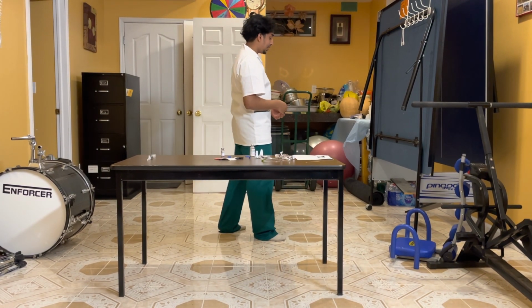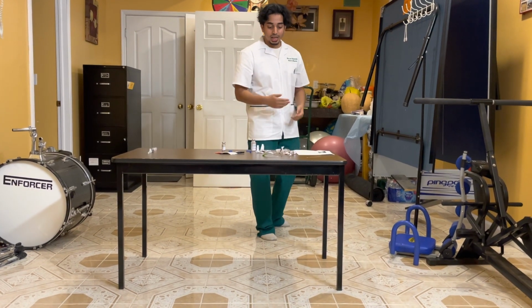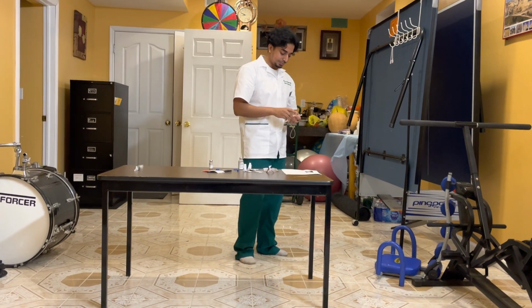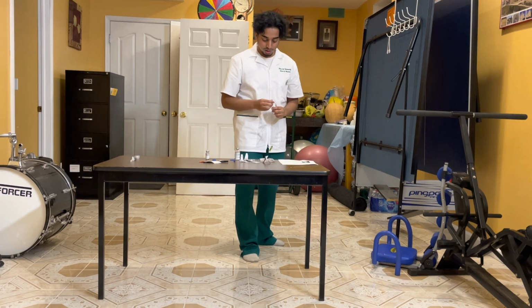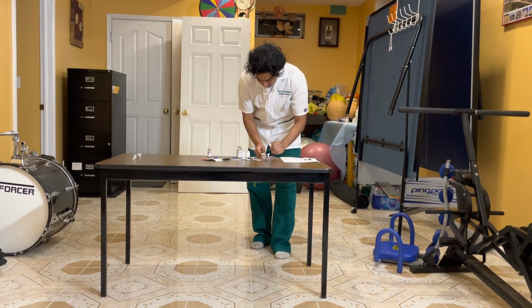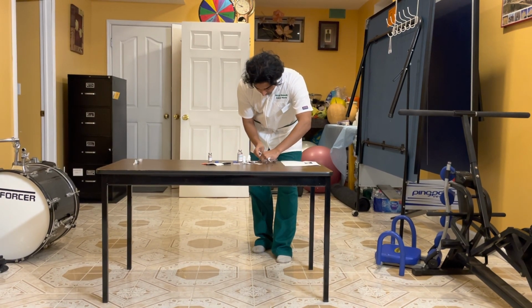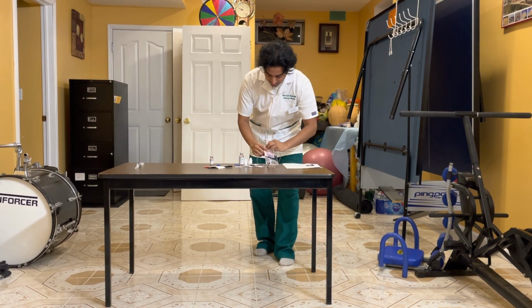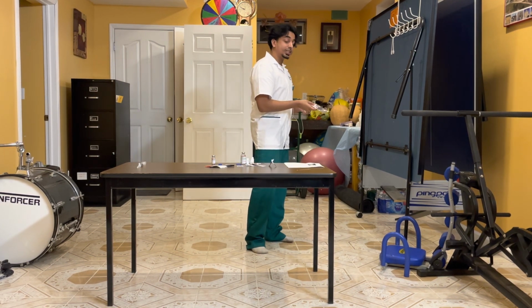Now once I've done that, since everything is perfectly fine and clear, it's time that I can insert the port. So now that I'm inserting the port, I uncap it. Once I uncap, I insert into the IV bag. Once it is inserted, the first thing I want to do is prime it.